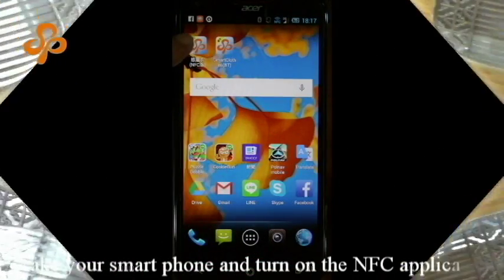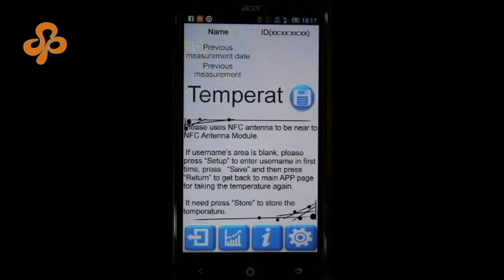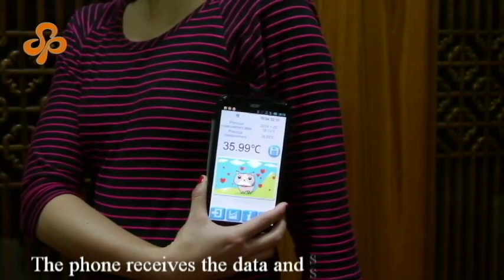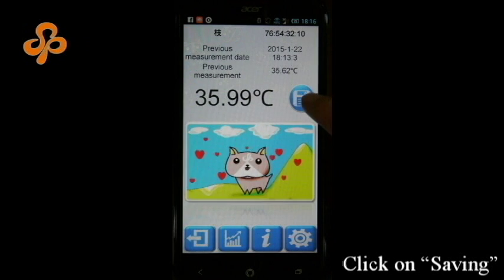Take your smartphone and turn on the NFC application. Press the phone close to the module. The phone receives the data and shows the temperature. Click on saving.